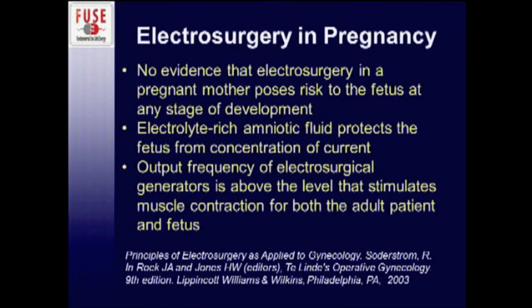Finally, if we move our spectrum of patients to considering our very youngest and smallest of patients with the fetus as a patient, electrosurgery in pregnancy, there is no evidence that any electrosurgery in a pregnant mother poses risk to a fetus at any stage of development. The amniotic fluid is very electrolyte rich, and it protects the fetus from concentration of current, and the output of the electrosurgical generators is above that level that stimulates muscle contraction both for the adult patient and for the fetus. And the only big risk there is if the fetus is directly touched by an active electrode, such as during an emergency C-section delivery. All right, that's just a couple points for children.